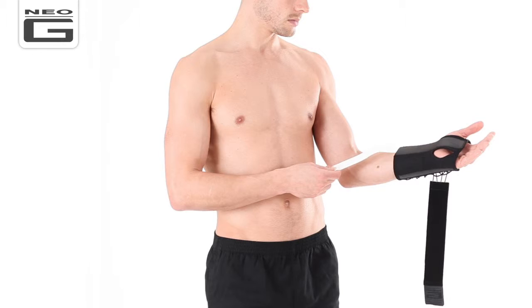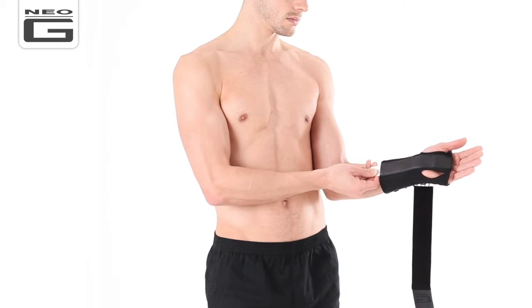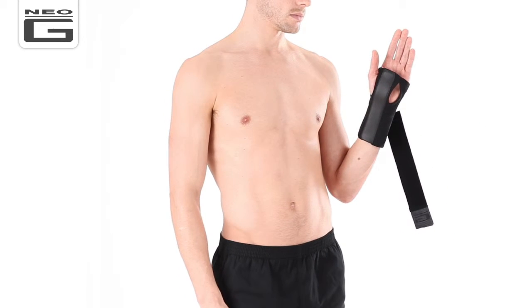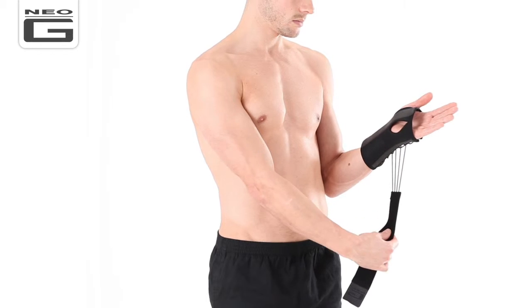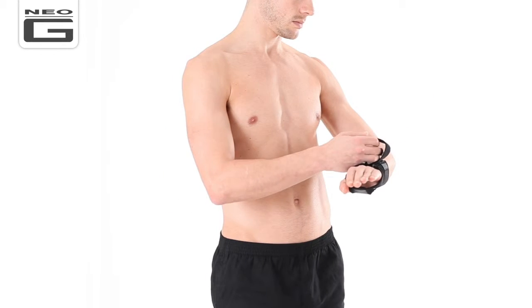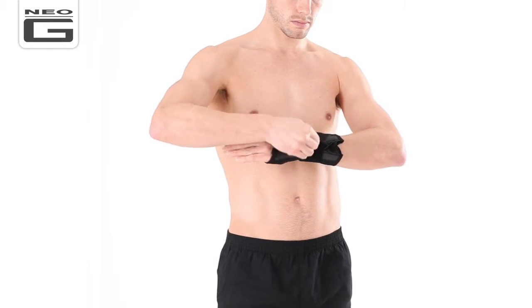It is constructed from specialist breathable fabric for comfortable daily wear and features a removable firm splint to allow variable stabilisation of the wrist and hand. The innovative lacing system provides additional compression and support around the wrist and hand if needed, which can help encourage correct alignment of the carpal bones and help reduce inflammation.